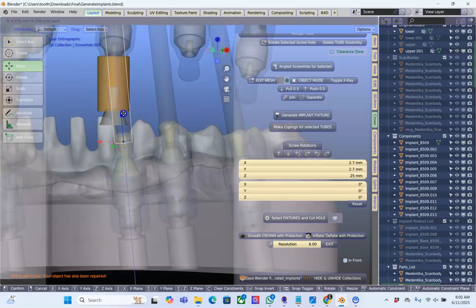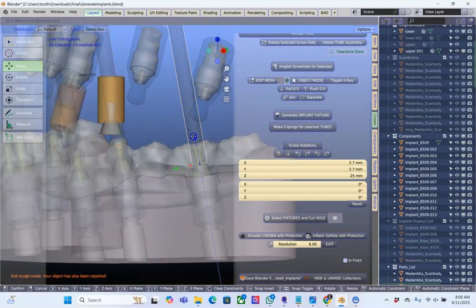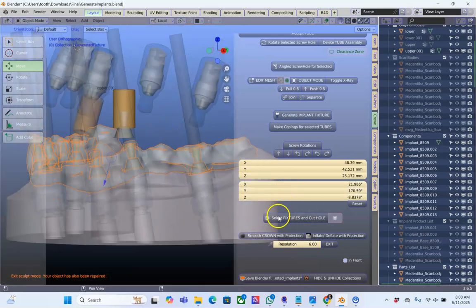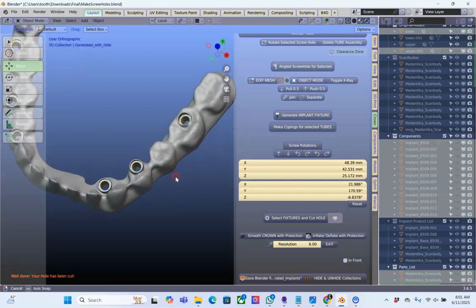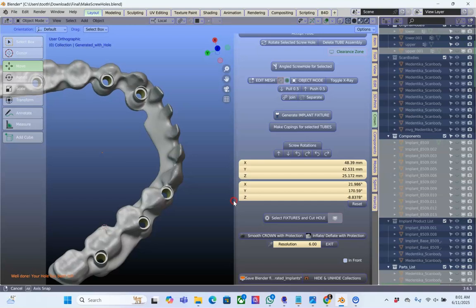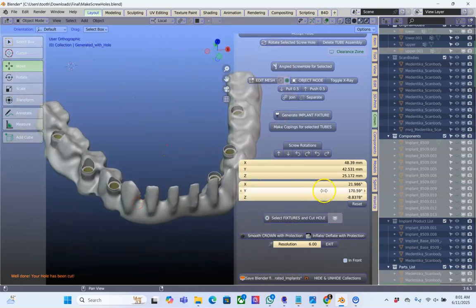So this is all done in the crown and bridgework module. Super, super cool. Mesh geometry is very, very good afterwards. So here, and then select fixture and cut hole. Okay, let's have a look at it. Here we go. Super, super cool. Holes, everything's intact. You can still smooth it a little bit.